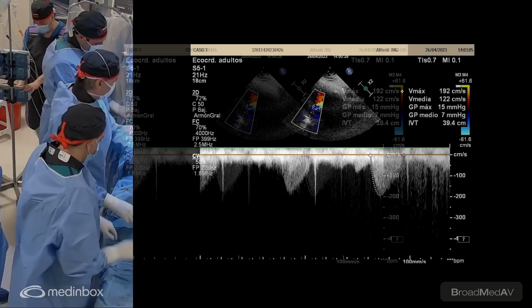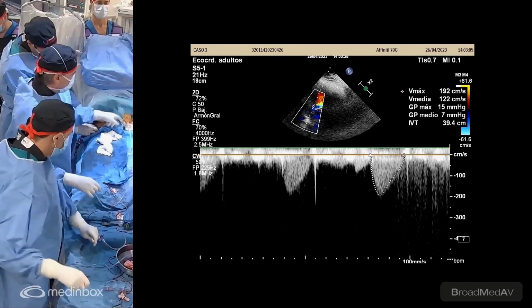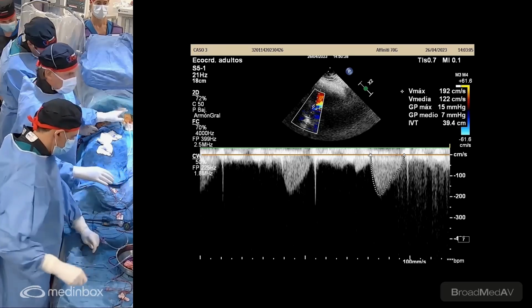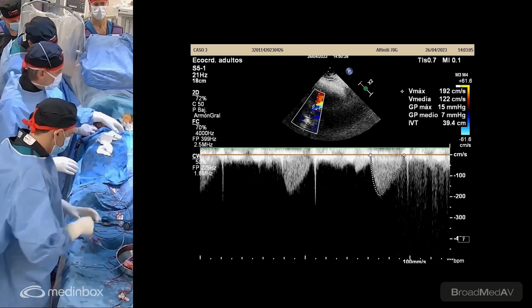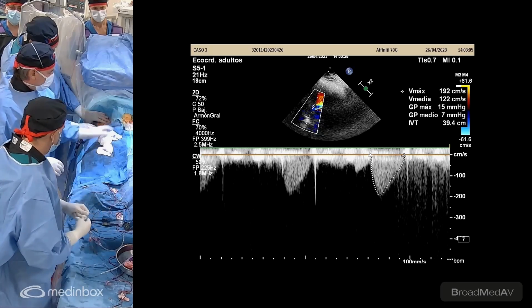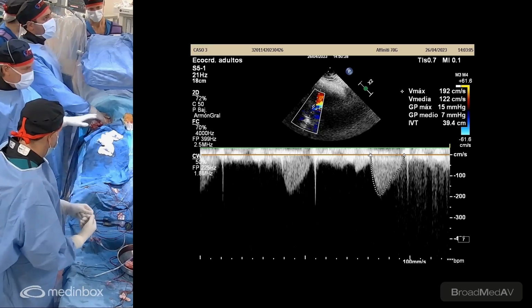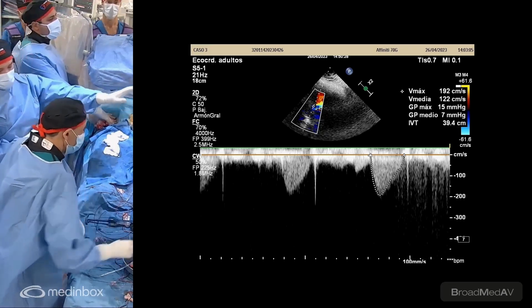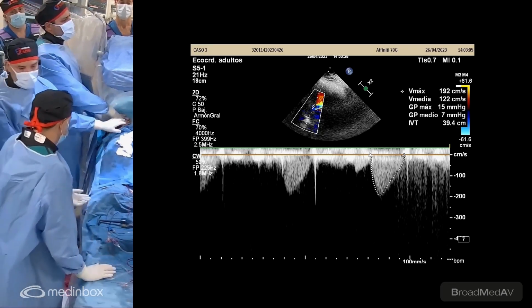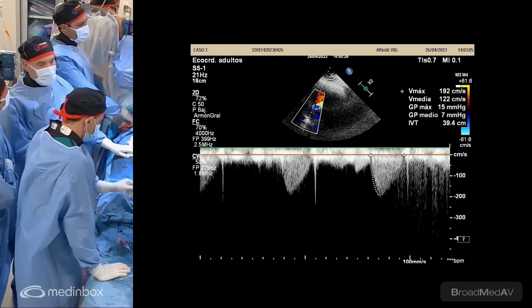So guys, our job is done here. Dr. Carlos Fava is going to fix the pacing wire for 12 hours at least, and we will pull out or withdraw the contralateral sheath. While Franco, although we don't have bleeding, we still compress probably for an additional 10 minutes. Good, excellent.